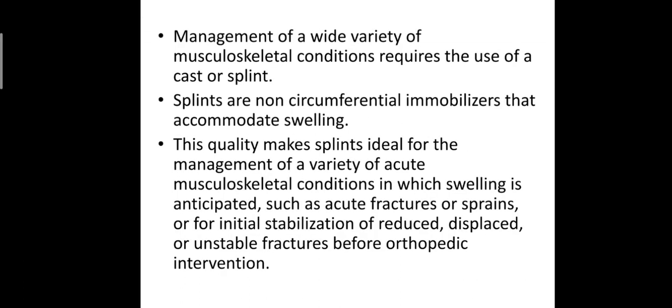Management of a wide variety of musculoskeletal conditions requires the use of a cast or a splint. A splint is a non-circumferential immobilizer that accommodates swelling.